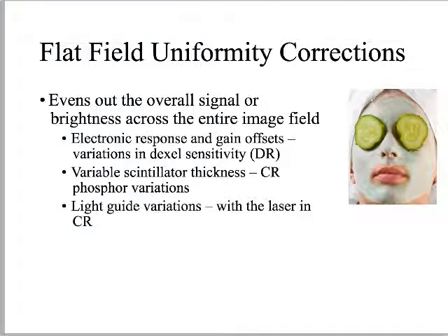So gain is just almost like feedback in the system. It's an inappropriate spike in the noise, right? It's a difference in the signal. I don't know if you've ever been listening to a public speaker, and the way they are holding the microphone is really making the P's pop. Like every time they say a P word like Pepsi, it's about to blow out the speakers, right? There's something about the way they're pronouncing that P sound that is causing this additional gain in the system. That's what we're talking about.